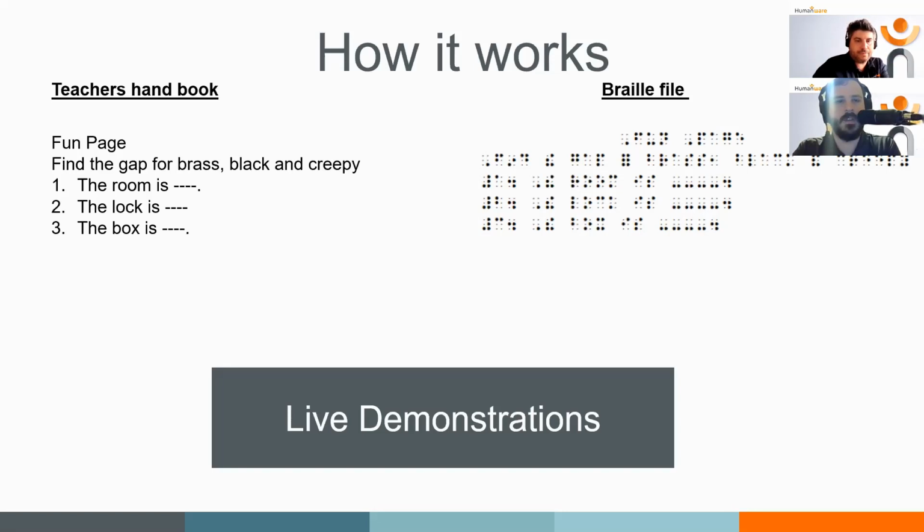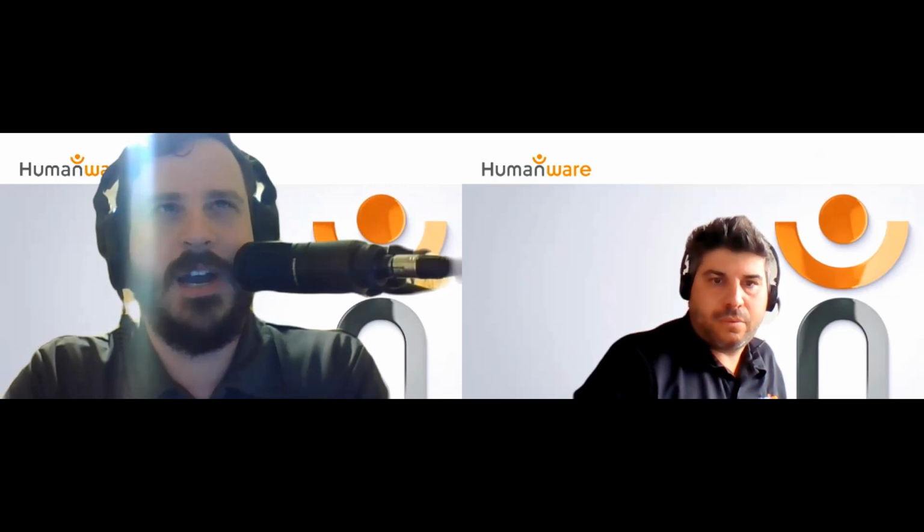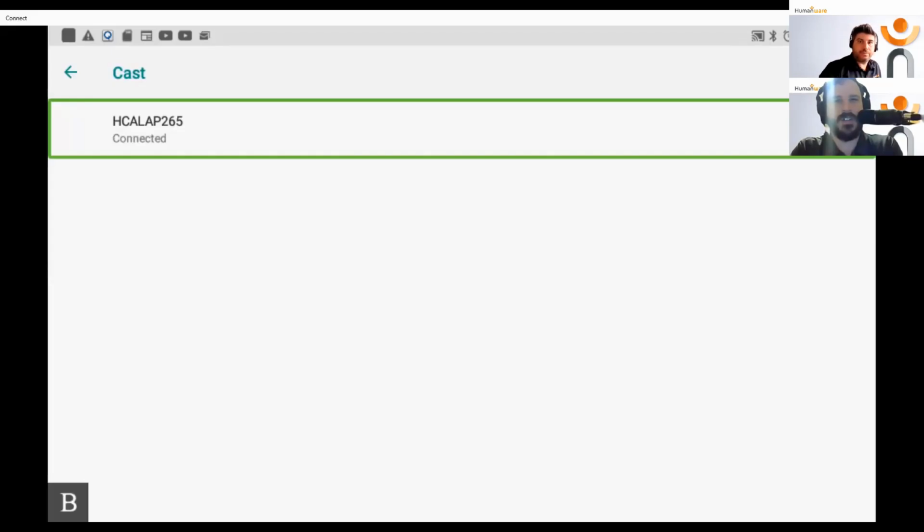And I'll take this time to vamp while Andrew does this. A lot of times, and I talk about this a lot for anybody who's ever attended any webinars or workshops I've done, it's about the importance of growing into a device and learning Braille, but also learning technology in lockstep. We hear a lot of hesitancy, especially here in the States, and I can't speak for the general trend in the UK, but I know it's always a struggle to know when we introduce technology and how we bring refreshable Braille to our young Braille readers and writers. How do we get the technology into their hands? Because we're always timid or we shy away from doing it because the Braille code might not be mastered. So what we're trying to do, and what this does, is it really helps us grow into our device.